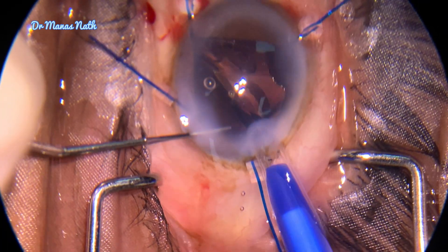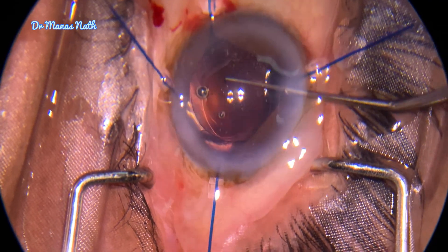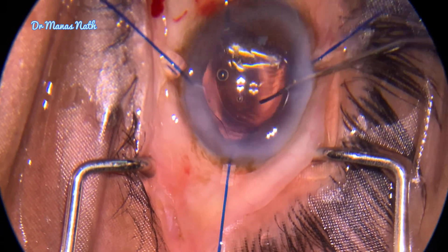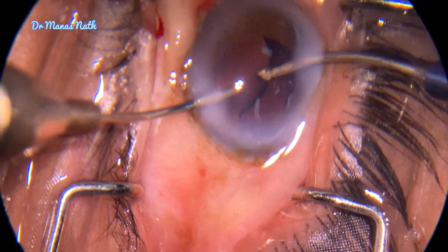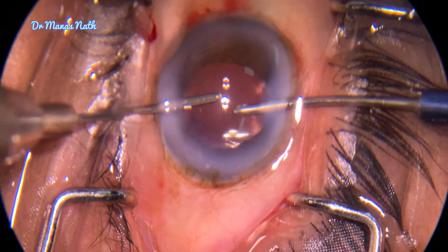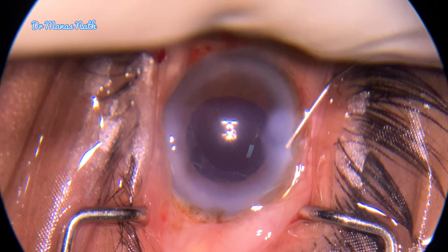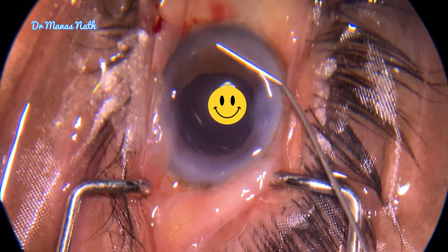Now placing a plate haptic IOL within the capsular bag — well centered within the bag. Now it's time to remove the viscoelastic, going below the IOL. Here you can see that the rhexis margin is oval with the plate haptic IOL, suggesting the zonules are quite weak. The chamber is well formed and the IOL is well centered.